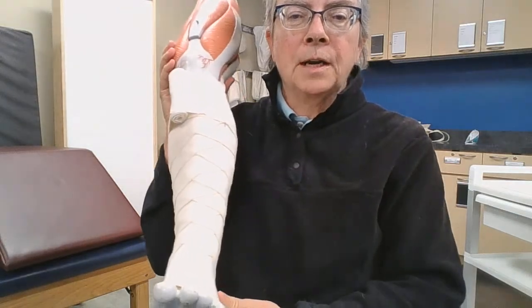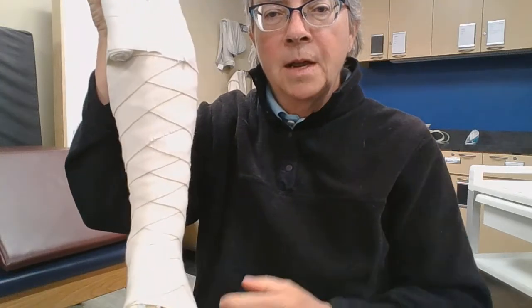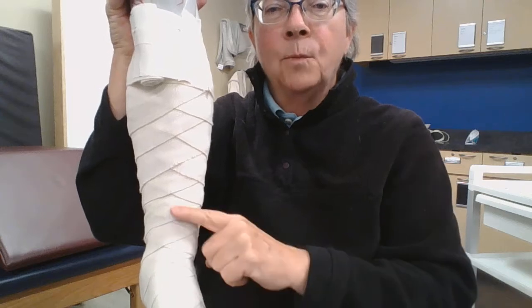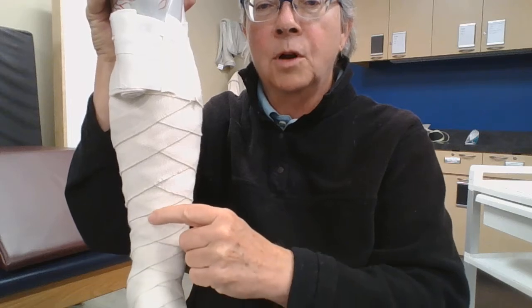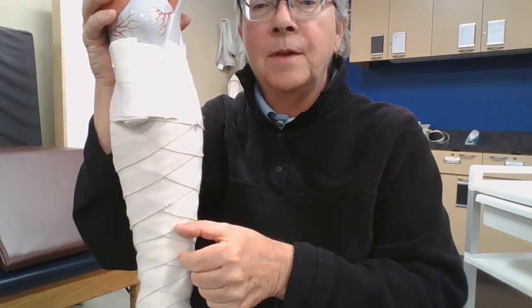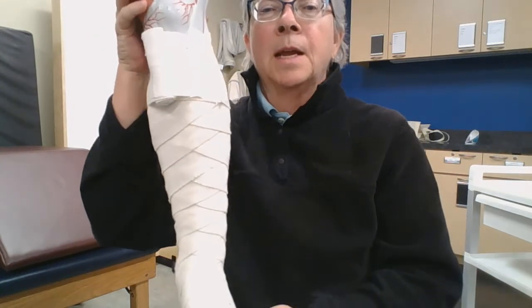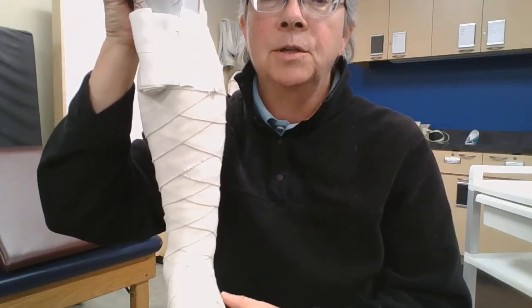And then, of course, we do a figure eight, right? Really important to do a figure eight. You can kind of see that here. Let me get the lighting correct for you. As you can see, as we're going up in our figure eight, we have an angle that's always going up, and we cross over, as you can see here, that we have a nice pattern going on. Boom, crossover, crossover, crossover, crossover. And we're keeping the same amount of fabric consistently, about 1.25 inches or so. So that is another feature that we always do, a figure eight, and I'll be showing you that.